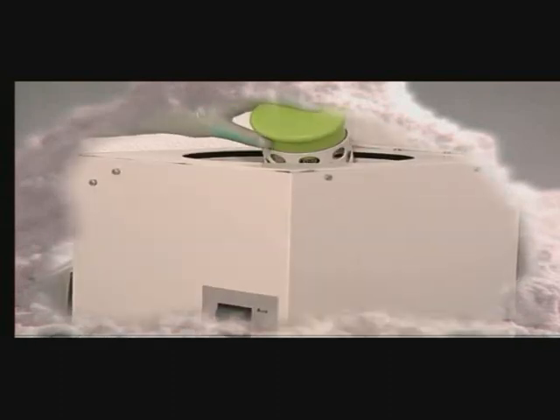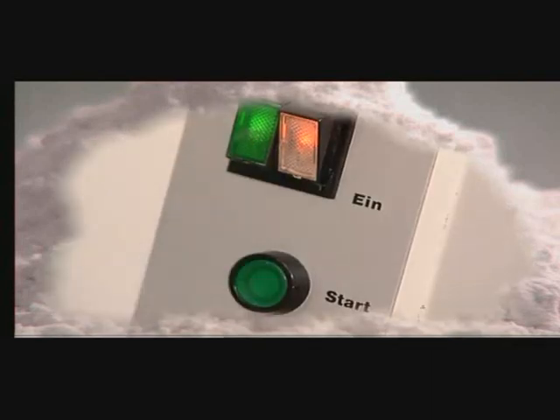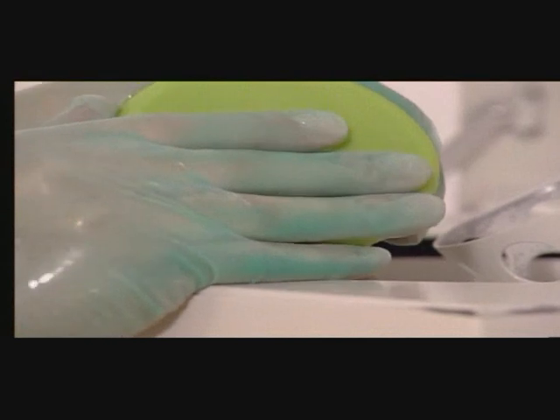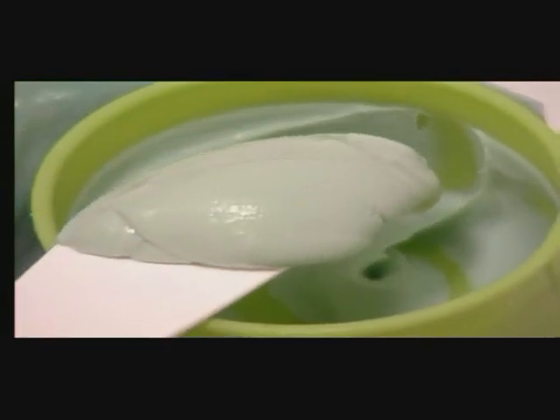The alginate is now spread expansively along the cup wall and air pockets squeezed out. The mixing time should also correspond to the manufacturer's specifications. In this case, it is 45 seconds with manual mixing. Machine mixing is much faster and always produces equally good results regardless of the individual mixing technique. The finished mixture is very homogeneous and in vacuum devices free of air bubbles. The consistency is much softer than with manual mixing.